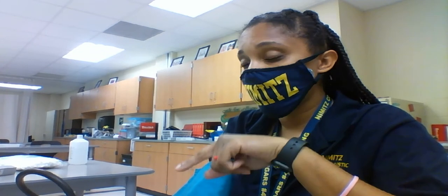Now, when you listen for a blood pressure, you're listening for the first beat. That first beat that you hear is the systolic number, the top number. Then it's going to trail off, and the last beat that you hear is going to be the bottom number, the diastolic. You are not a robot, so it is not beep, it is beat.